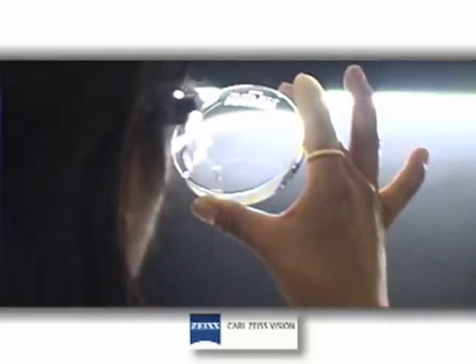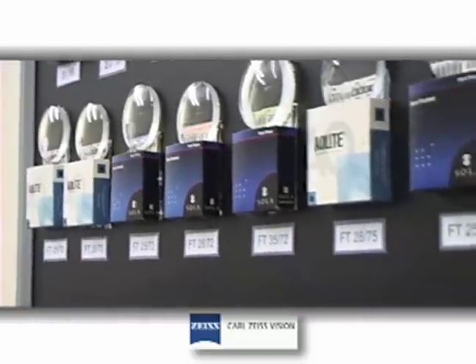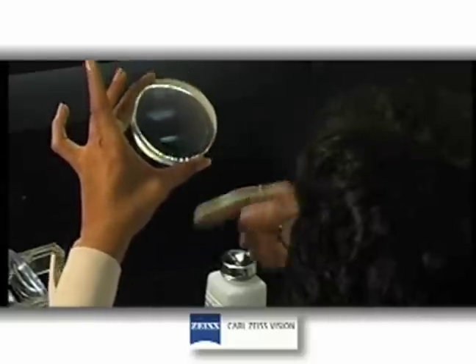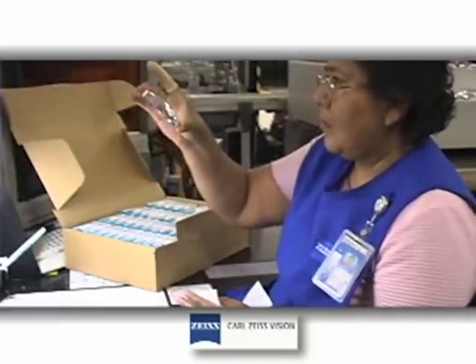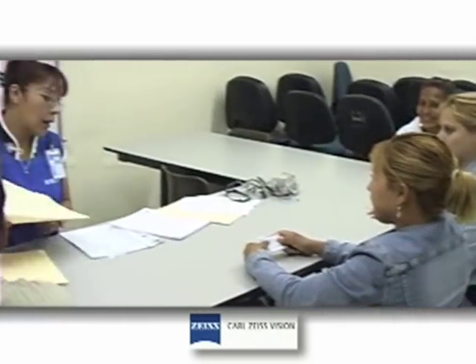Using your depth perception skills is also a large part of inspection. Understanding when defects are internal, superficial, or on the back side of a lens can be difficult for the eyesight to learn. Encompassing all the steps of inspection into one continuous flow is the most difficult to learn while using the required specifications.